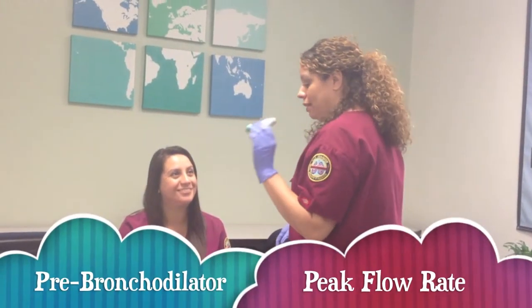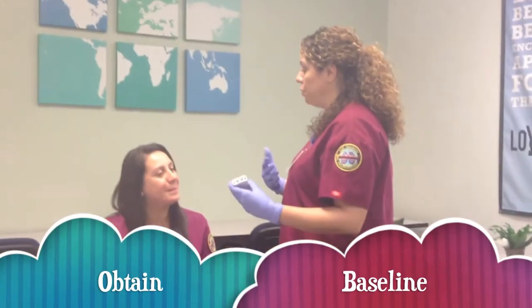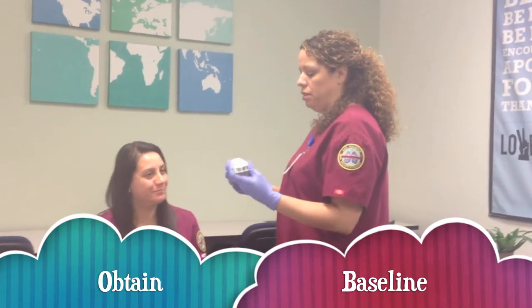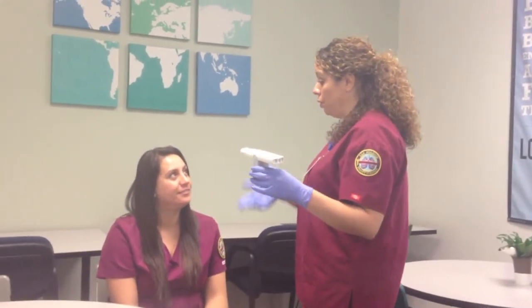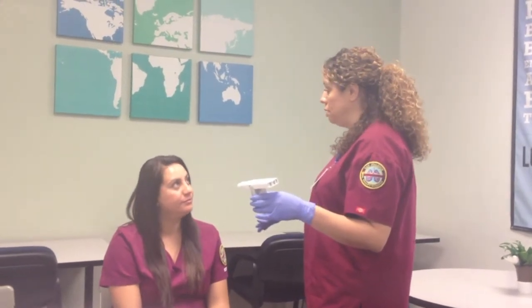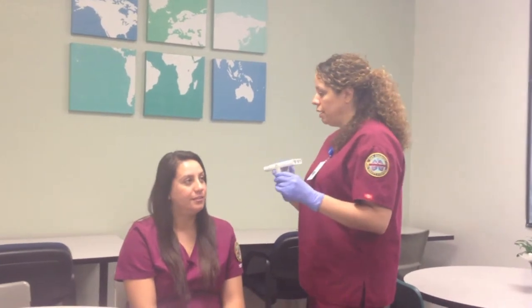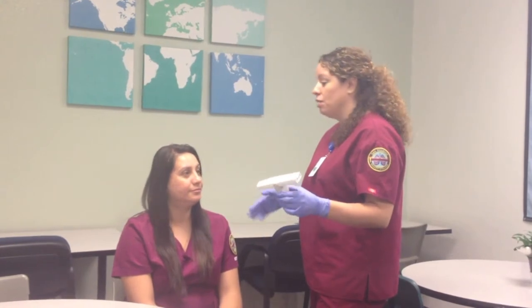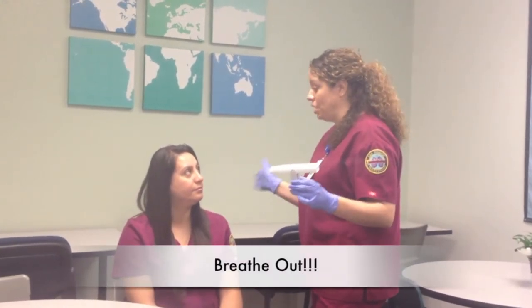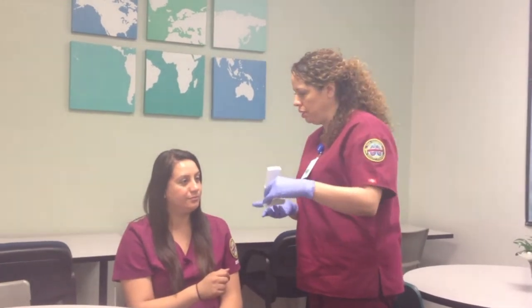Now I want to talk to you about this peak flow meter. What it does is it helps to measure how forcefully you can breathe out. We're going to use it before your inhaler and then after, and hopefully we'll see some improvement. So how this works is you're going to make a nice tight seal, breathe in, and then breathe out as hard as you can. And when you think you can't breathe anymore, I want you to keep going. Do you have any questions before we get started? No.